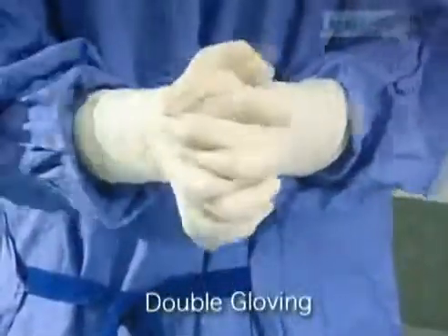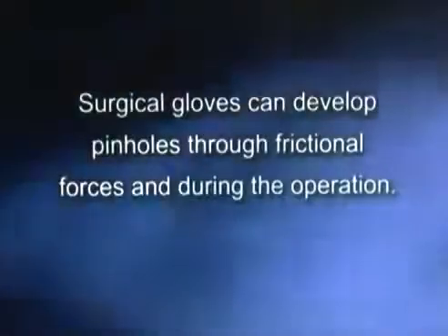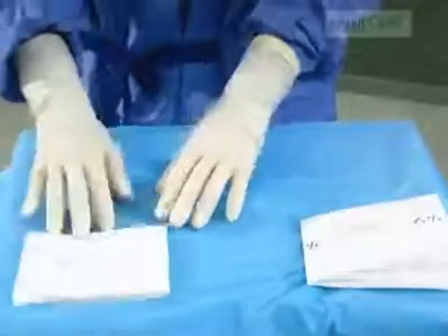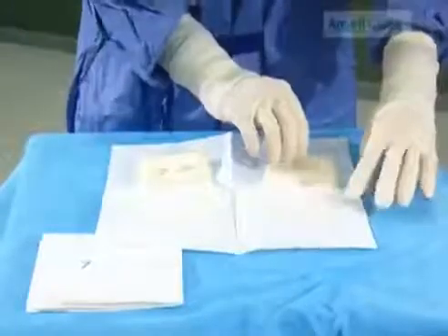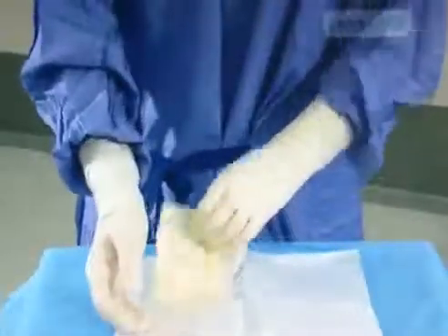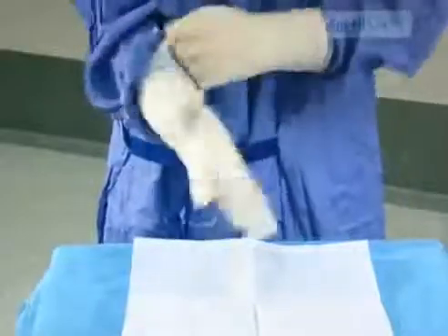Double gloving, or donning, is recommended as studies have shown that surgical gloves can develop pinholes through frictional forces during the operation. It is also recommended to change the outer glove every 2 hours. The dominant practice for fit and comfort is to wear a half-size larger glove on the inside and your normal size on the outside. You will need to experiment to see which method is more comfortable for you. Further information about double donning is available on this disc.